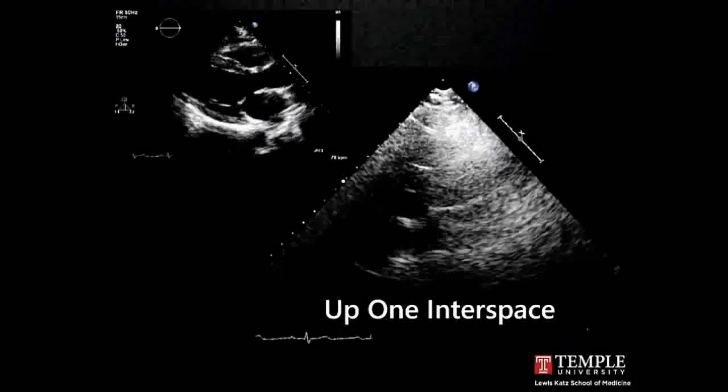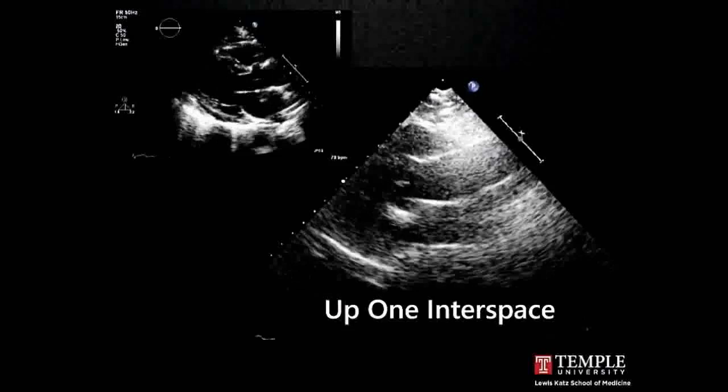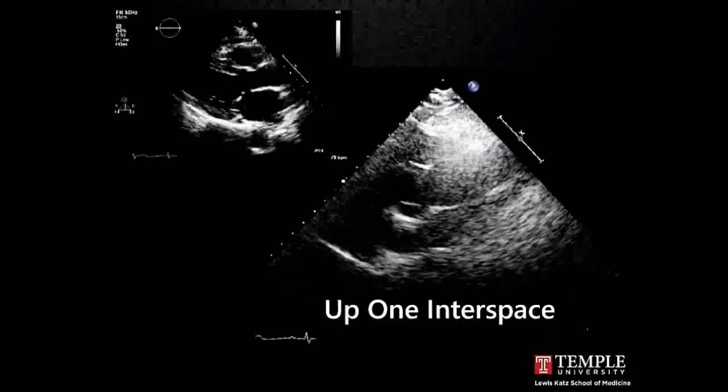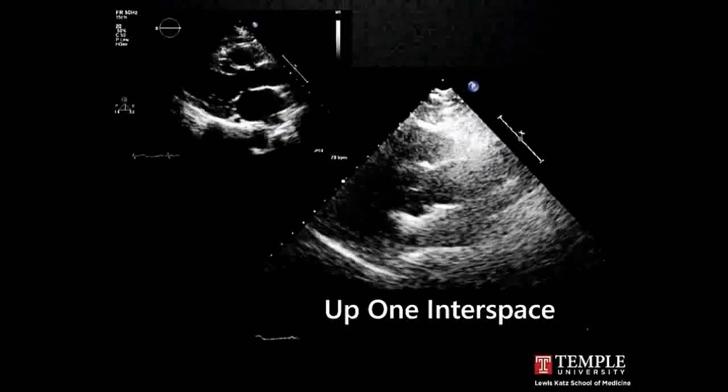If you imaged from the on-axis image and you went up an interspace, what type of image would you be looking at? You'd be looking at the ascending aorta. Sometimes it's pertinent, but it's not an appropriate parasternal long axis view. Even if you tweaked it to get the ventricle in view and you can somewhat see the LV function, it's not a standardized view. So it's important to recognize how, as you move the probe, you can acquire different images that are all part of the normal echo, but represent different cardiac structures.